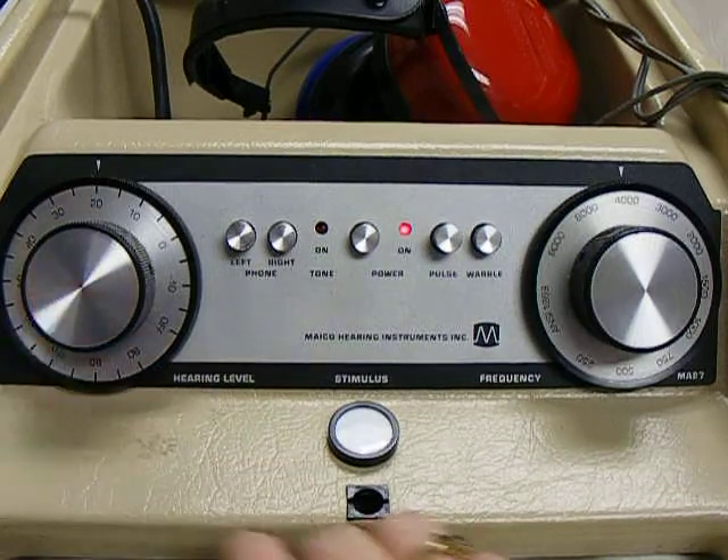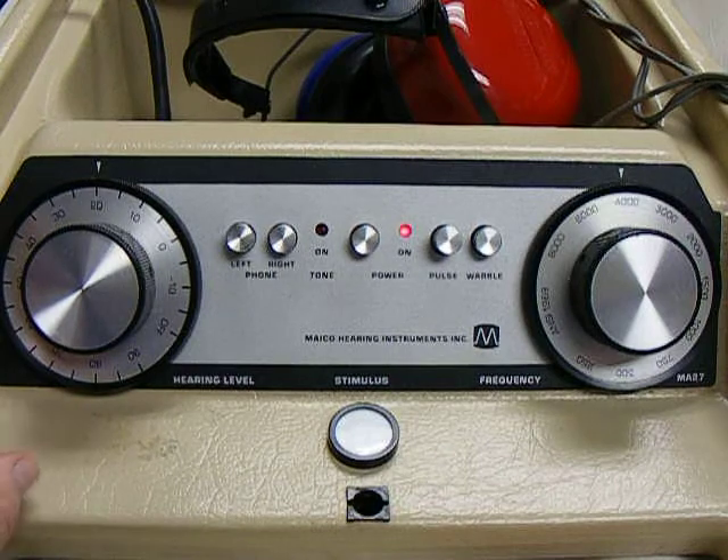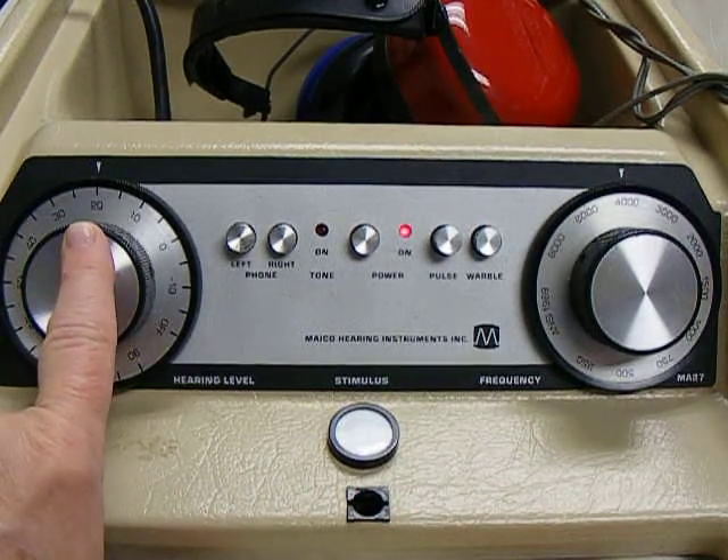This knob controls the loudness or intensity of the tone. The larger the number, the louder the sound. A student must pass at 20 dB.